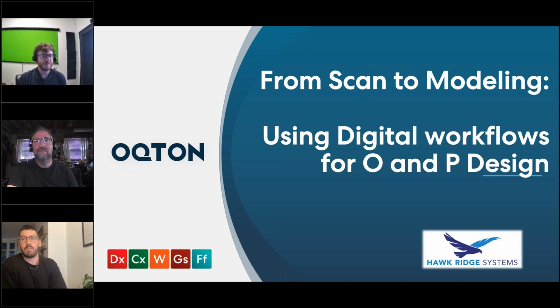My name's Guy Bottle. I'm the product marketing manager for the Geomagic portfolio at Oqton. Today I'm going to be hosting this webinar alongside two guests. As you can see on the screen, we'll be taking a look at Geomagic Freeform and some of the applications that we have been seeing it being used for in O&P design, in particular using automated workflows to aid in the design of orthotics and prostheses.